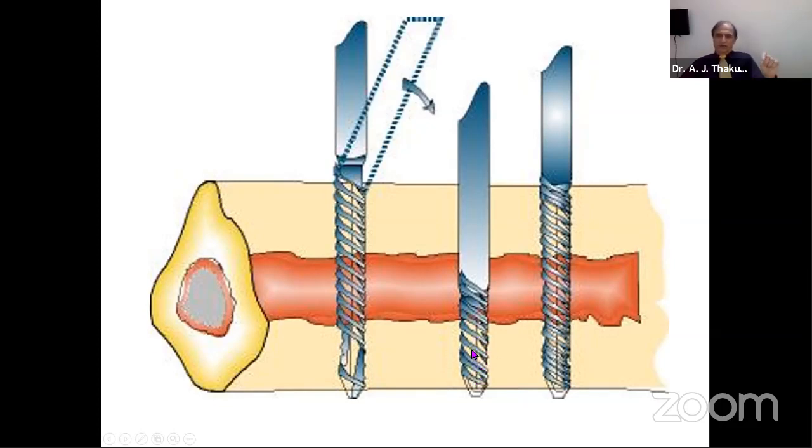That's why this tapered screw or tapered drill bit makes two advantages. It produces the radial fit, or radial interface, and a radial preload, sorry, that is the right one, and produces radial preload both at the far cortex and also at the near cortex as well.